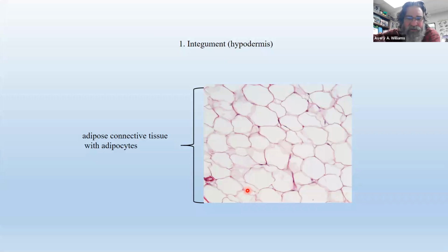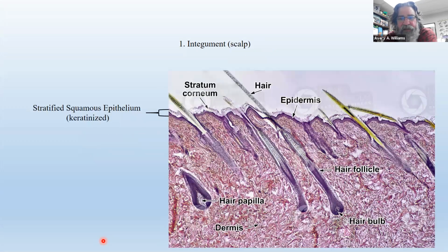The nucleus and all the other cytoplasmic organelles just kind of get pushed over to one side. And usually what's filling up the space is all that lipid droplet. It's like a little oily droplet. I don't know if you ever handled chicken fat or some kind of animal fat. It's kind of oily, greasy. That's lipid that leaked out from your adipocytes. Okay, so there you go.